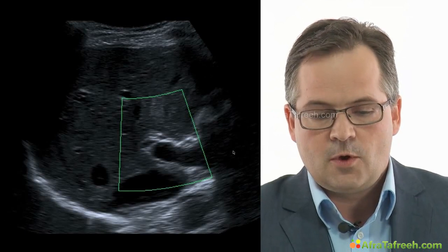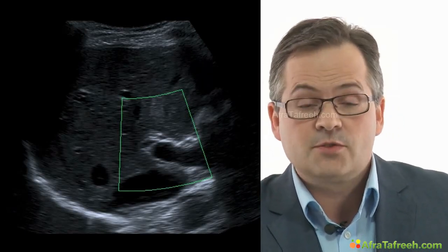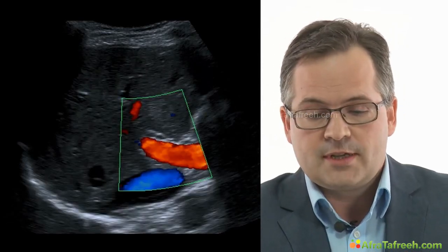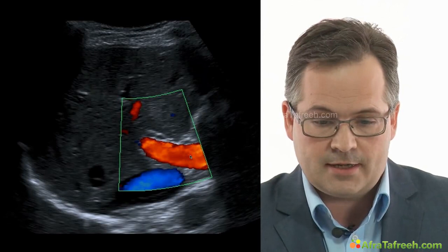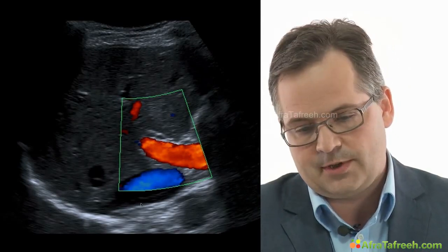So, when you want to assure that we scan the portal vein, we can use color Doppler. It doesn't matter where we see red or blue signals, but so we can be sure that this is the portal vein and we do not mix it up with the common bile duct. The second vessel in this plane is the IVC over here.